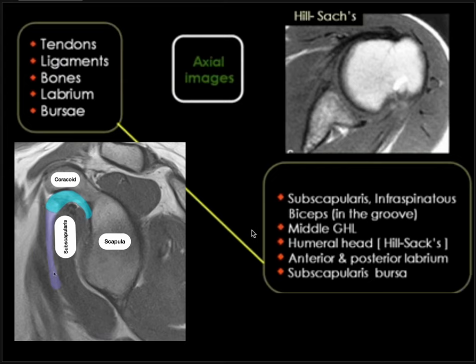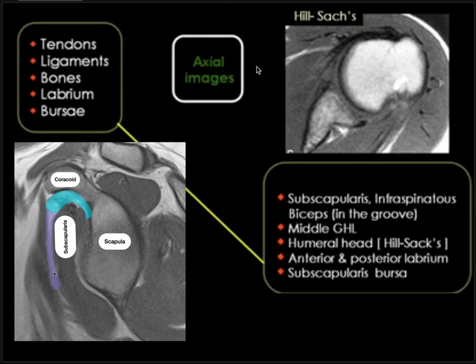On axial sections: we can see the subscapularis muscle, tendon, and insertion; the infraspinatus muscle, tendon, and insertion; the biceps between them; and the transverse humeral ligament. Bone-wise, we can see all the bony anatomy. Labrum-wise, we can see anterior and posterior labrum, with the middle glenohumeral ligament in the anterior labrum.